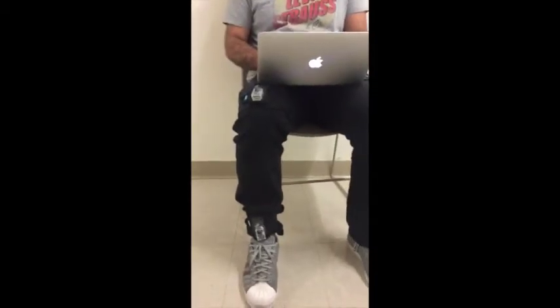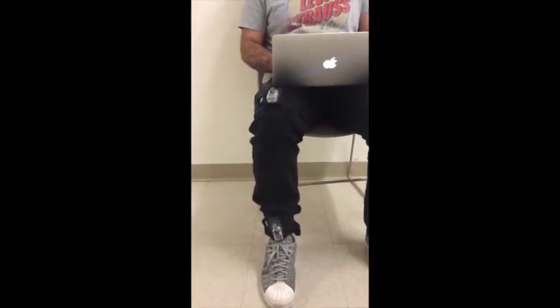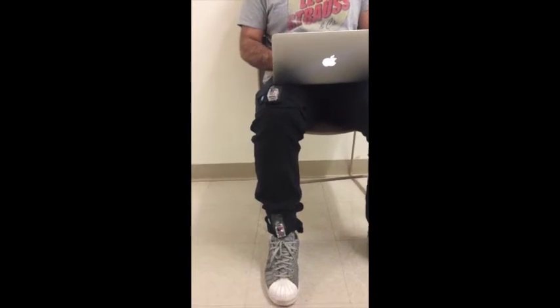So this is Shayan, and he's going to be doing the sitting test. So Shayan is going to be operating on the laptop and sitting at the same time. And he will be sitting down for 10 seconds, and the Beagle will collect the data from there. So whenever you're ready. Okay, can do this. Notice that the sensor is not blinking, so it's collecting data. And the data is finished now.